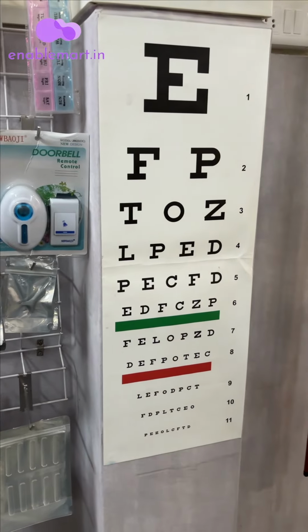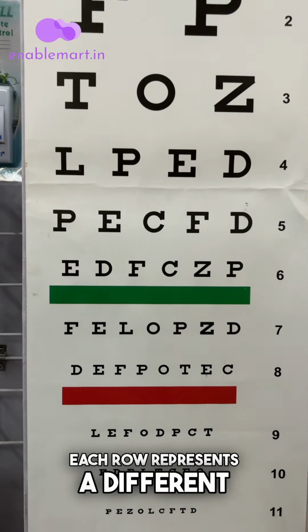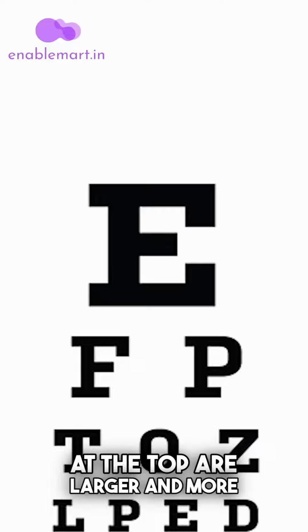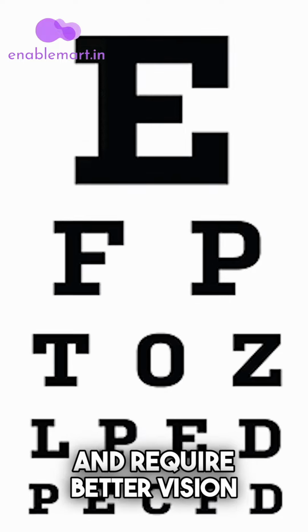As you can see, the Snellen chart consists of letters or symbols arranged in rows. Each row represents a different level of visual acuity. The letters at the top are larger and more easily visible, while those at the bottom are smaller and require better vision to identify.